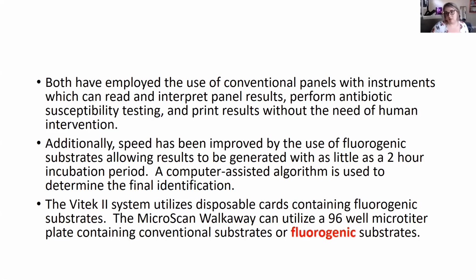So speed, because basically what they're saying is once the growth reaches a point where it can be identified, we used to wait till the next day to bring them back out like we've done here in lab and read them. That may be 24 hours since you put it in. But what these systems do is they monitor them, and if the ID can occur faster, it IDs it. So the idea of, hey, I got to wait till the next day to know what organism I have, these take that out. They actually do those as they become positive.